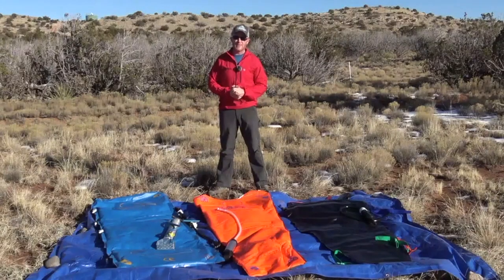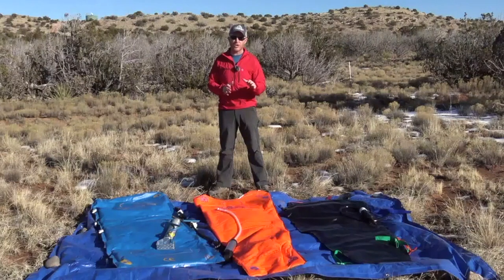Hello, I'm Dr. Tim Durkin for the Base Medical Team. In this video, we're going to talk about vacuum mattresses, which are an excellent, lightweight piece of equipment for use in backcountry rescue.